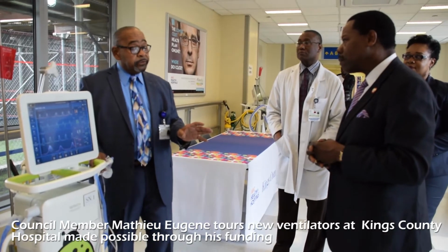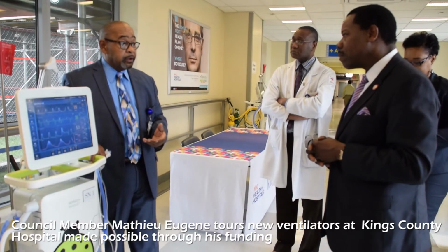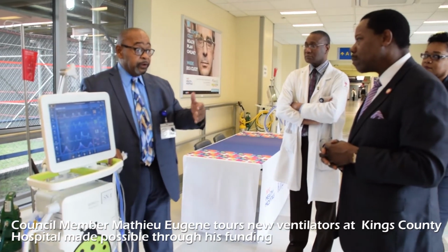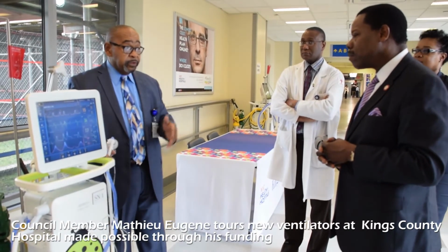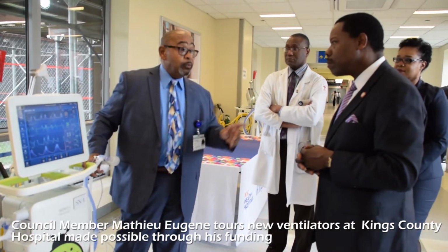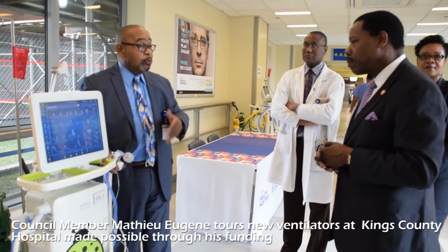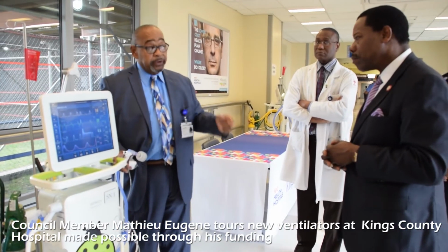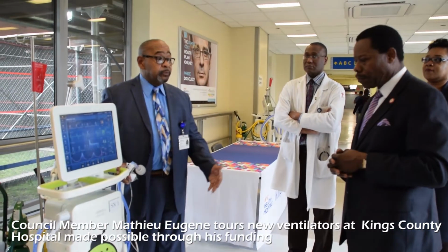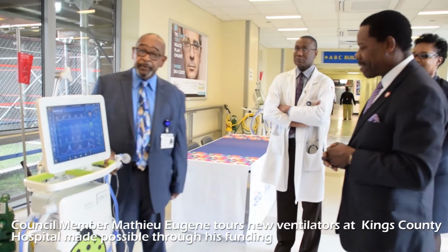The other thing you need to understand is that between patients, a test called the pre-use check is performed on the machine. The pre-use check guarantees that the ventilator is functioning within our specified ranges, so they know before they put it on a patient that it's safe. If there was an issue with software, for example, they would find that out during that pre-use check, so it would never actually be put on the patient. But if it's on the patient already and there's an issue, you're going to get an alarm. So the system will tell you there's a problem. Safety first.